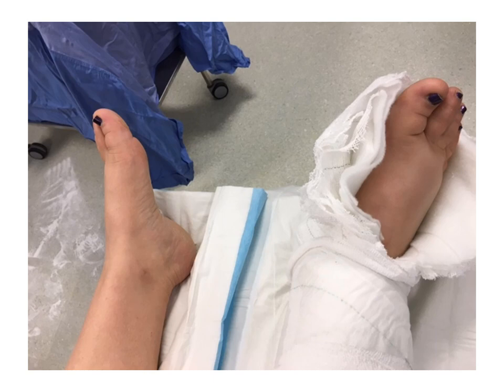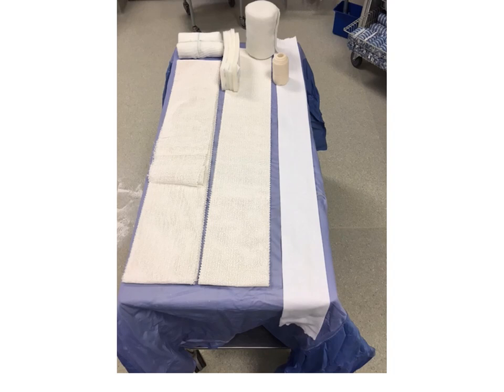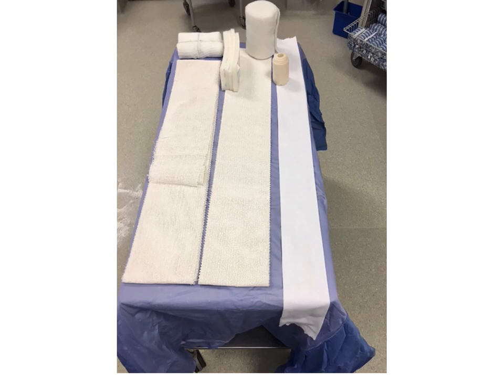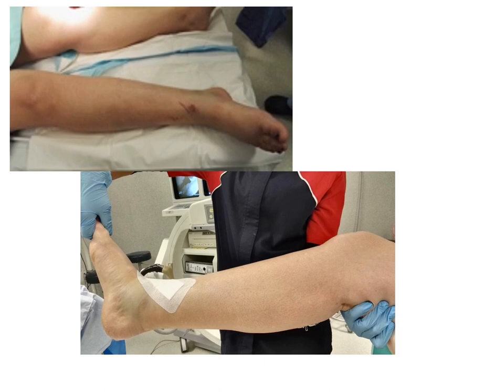Five to seven days before surgery can be undertaken. Here is the material described earlier: gypsona in two slabs — the one on the very left for the side slab, the one in the center measured out for the back slab using two gypsona bandages. There are two Elastoforms, rest-on foam cut into four pieces, stocking net, soft band, and a roll of Elastoplast which has been unrolled and re-rolled so it is not too sticky and can be applied without too much tension. When the original backslab was completely removed, an unmanaged, untreated abrasion on the anteromedial aspect of the patient's ankle was also found, requiring dressing.